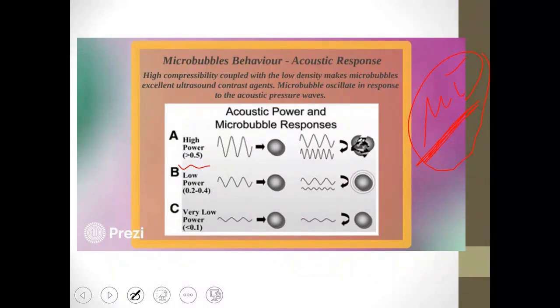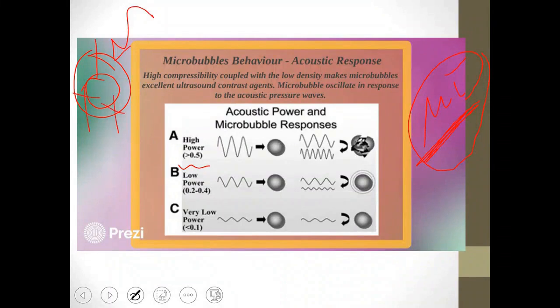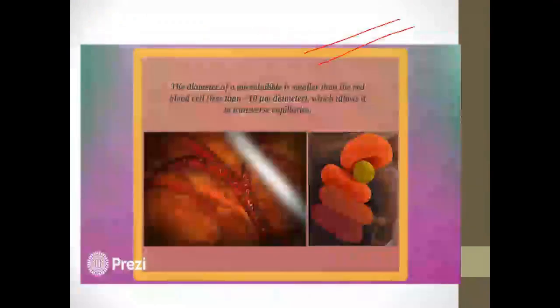It may be used in targeted therapy. In drug delivery, for example, if someone wants to release the internal components of the microbubbles or the nanoparticles present, they can use high power to rupture the shell of these nanoparticles, thereby releasing the substance inside. This is used in drug delivery systems or in the treatment process, okay?